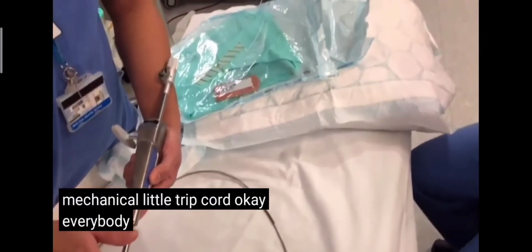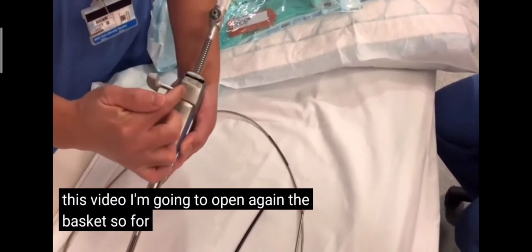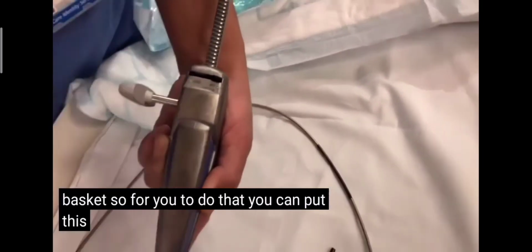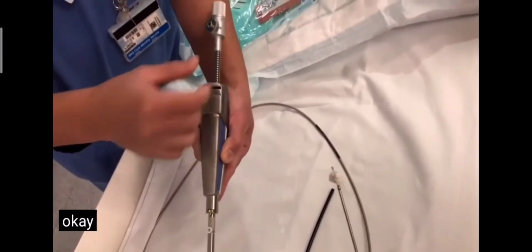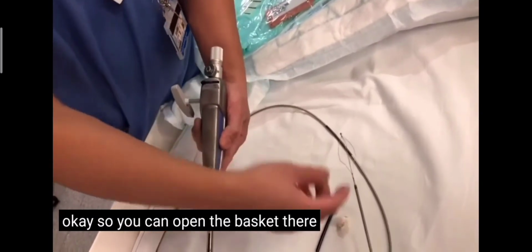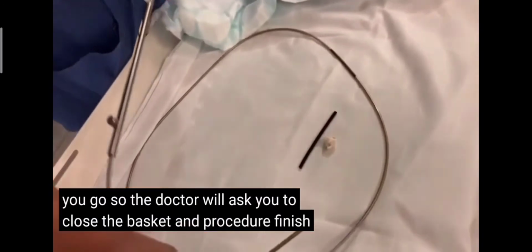Okay, everybody happy? For the purpose of this video, I'm going to open the basket again. For you to do that, you put the ratchet to off. Then you can open the basket. There you go. So the doctor will ask you to close the basket and the procedure is finished.